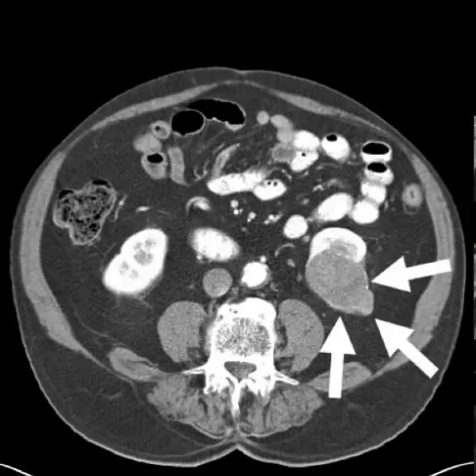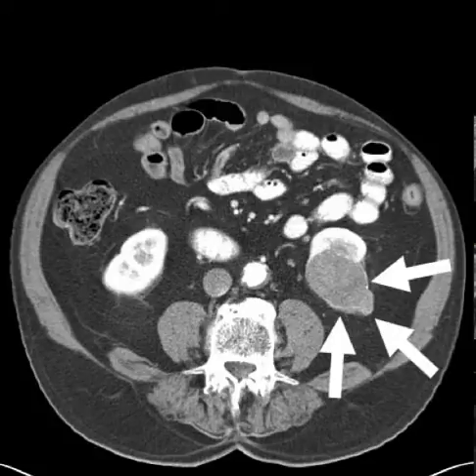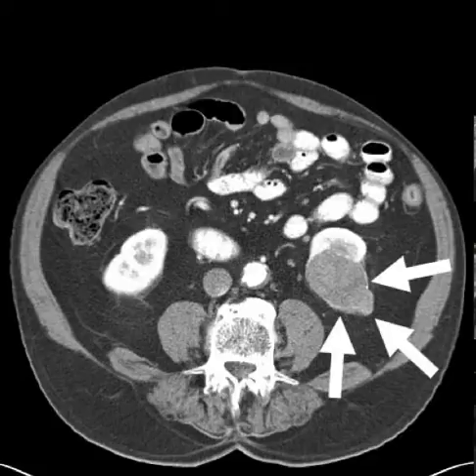I would feel more comfortable definitely going with a pre-contrast exam and a post-contrast exam and measuring that density, so that way you're sure you're not missing an important diagnosis here. As far as MRI goes, we use percentage of enhancement. It's a slightly different formula based on signal intensity, but it's also going to be 15%.